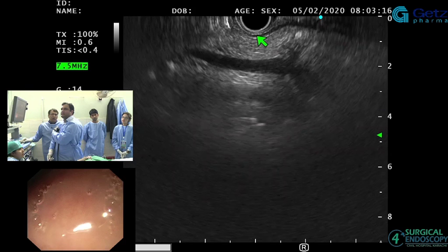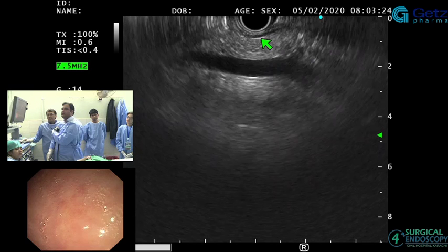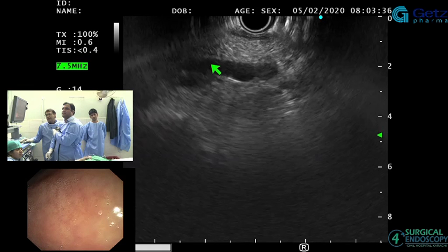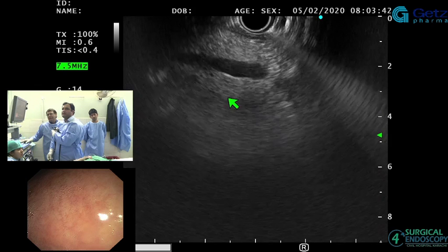Dr. Khalid, can you tell us about the vascular structure? So which one is SMV and which one is splenic? So here, we need a view. So this is a splenic vein right here, which is coming from this side, and it's connecting with the SMV, duodenal bulb. And there's a portal vein, which is going up here. We're just not in the best position right now to show, but he's doing pretty good. Overall, at least bringing some structure. So let me see.